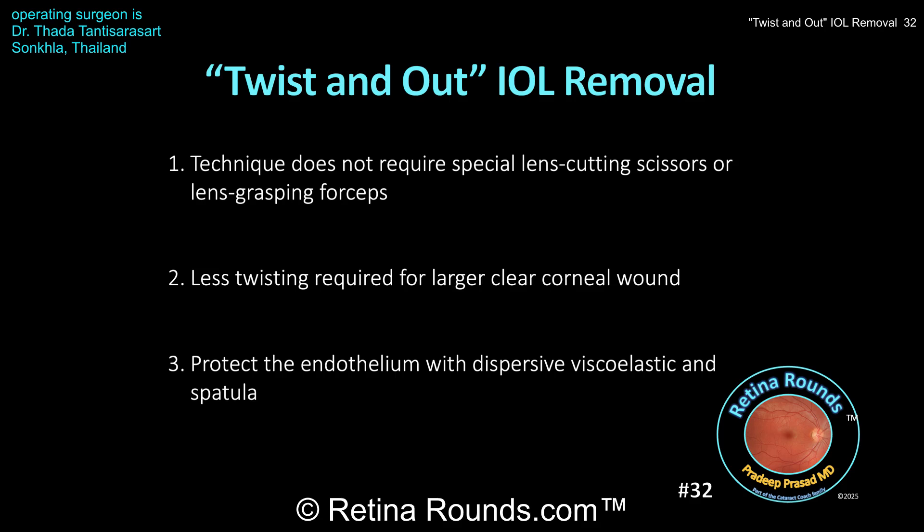When an IOL is being removed at the same time as part of the pars plana vitrectomy, regardless of the size of the clear corneal wound, I recommend closing that wound with a 10-0 nylon suture just to make sure that it's watertight. There can be some manipulation of the globe, especially with peripheral scleral depression, and you don't want any of those pressure dynamics causing the corneal wound to open. So that means you can use a larger wound in these cases, which can make it a little bit easier to remove this lens using this technique. The lens doesn't have to be twisted too much — just effectively in half or a little bit more than half to externalize through the clear corneal wound.